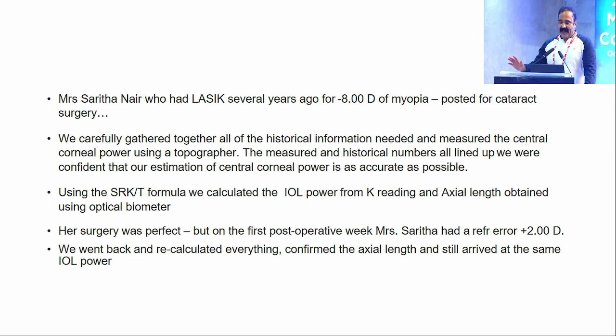We carefully gathered all the history and information needed and measured the central corneal power using a topographer. The measured and historical data lined up, and we were confident that our estimation of central corneal power was as accurate as possible. We used the SRK/T formula and calculated the IOL power. Axial length was obtained using the optical biometer. Absolutely no issues with the surgery, IOL in the bag.